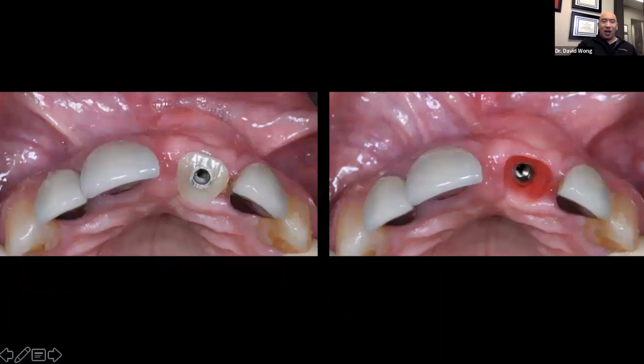But some people are like, yeah, but I had Vulcan already make the temporary crown. Well, who cares? No big deal. So what you're going to do is just put the temporary crown in, and then chop it off at the gingival margin. And now you have what? You have a custom healing abutment, like you see here.